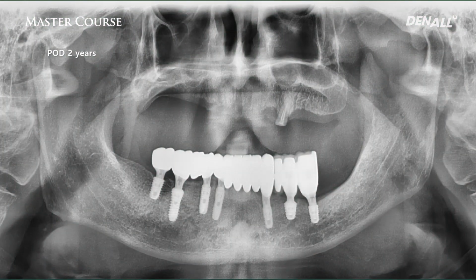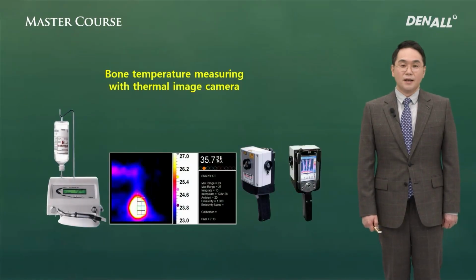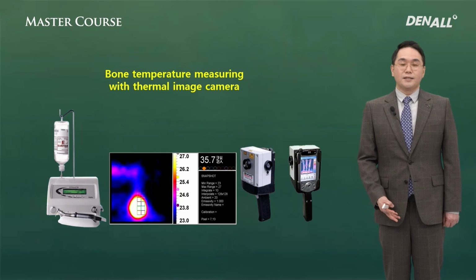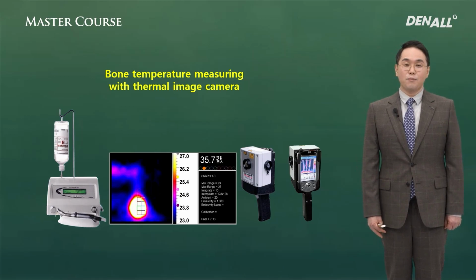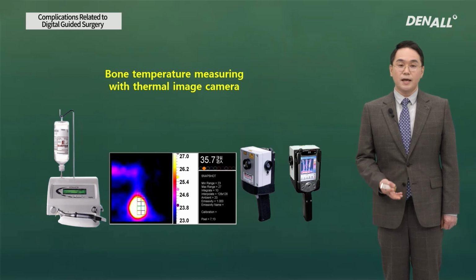This is 2 years after surgery and there's no marginal bone loss. This is the panoramic image in the 2nd year, and this is the follow-up. We talked about thermal damage in relation with guided surgery, and this occurs quite frequently.